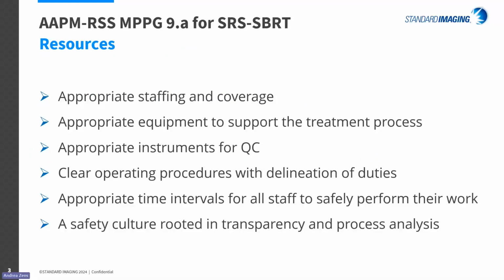So let's get into it. As you well know, there are many guidelines, task group recommendations, codes of practice, regulations, and so on related to stereotactic programs. Since the AAPM RSS Medical Physics Practice Guideline 9A was developed to provide appropriate minimum standards for LINAC-based stereotactic services, let's start there.